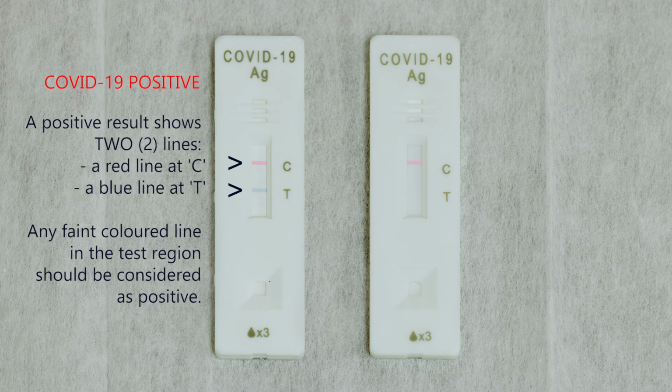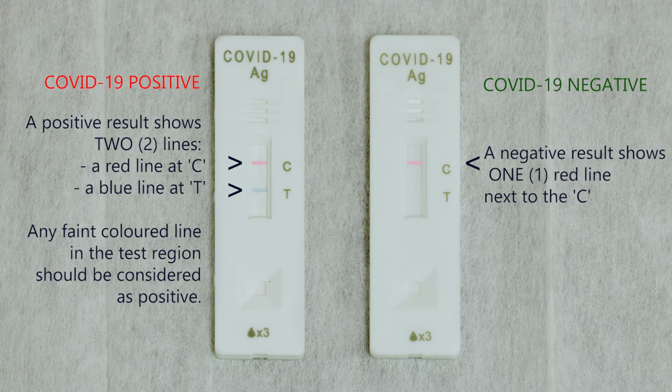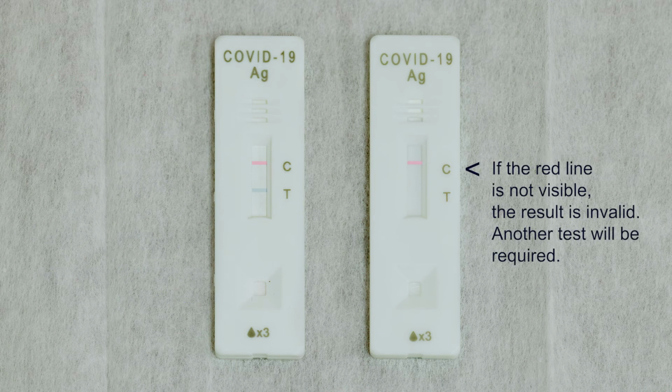COVID-19 positive. A positive result shows 2 lines, a red line at C, a blue line at T. Any faint coloured line in the test region should be considered as positive. COVID-19 negative. A negative result shows 1 red line next to the C. If the red line is not visible, the result is invalid. Another test will be required.